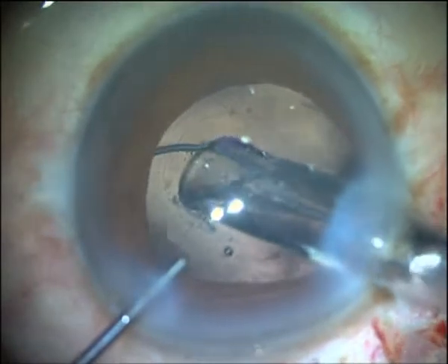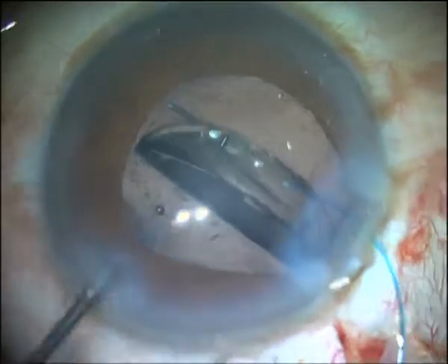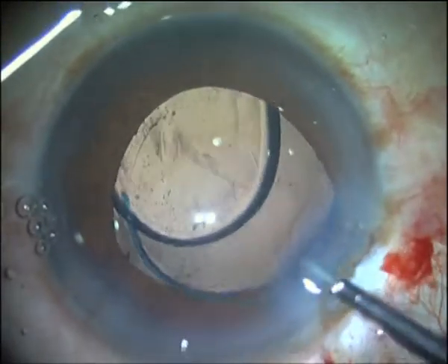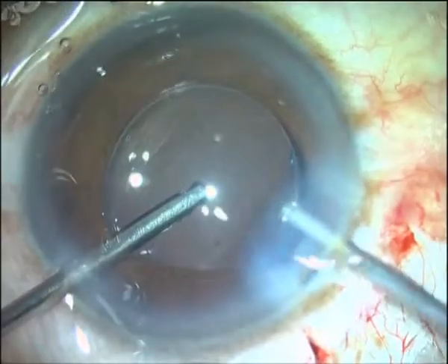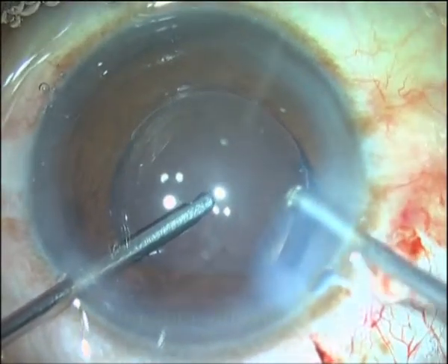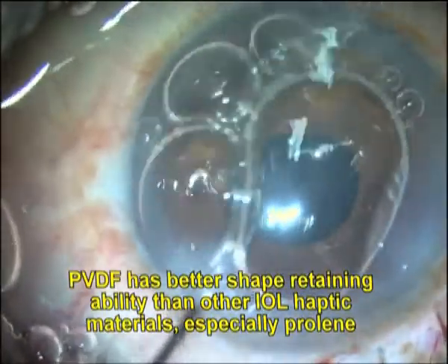We designed this new device using PVDF of about 130 microns diameter, the same material and gauge used for manufacturing IOL haptics. It hence has a long and safe track history of biocompatibility within the eye.